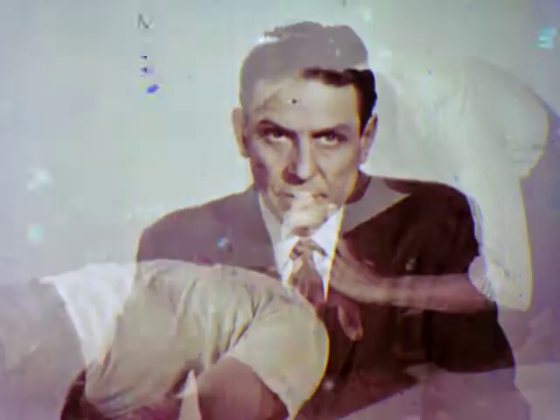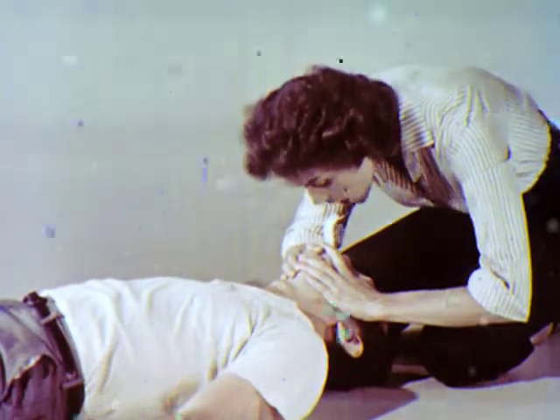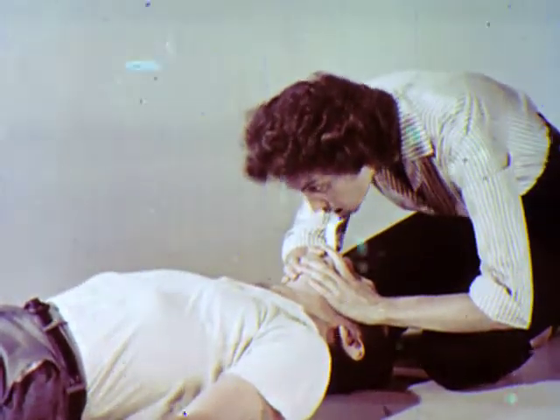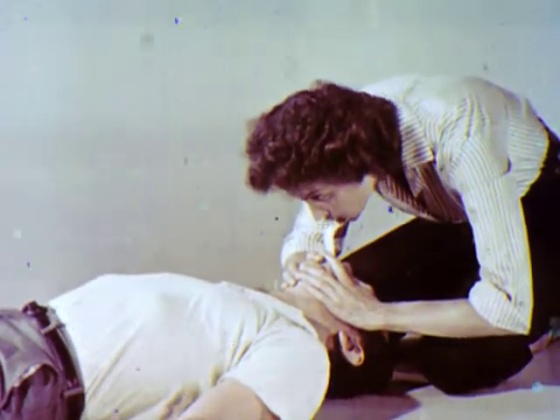Remember, any type of accident causing unconsciousness may result in asphyxia. A non-breathing person will die in a very few minutes if air has not gotten into his lungs quickly. Practice the methods of exhaled air resuscitation you have just seen. In the mouth-to-airway method, insert the short end for practice purposes. In an emergency, if the resuscitation tube airway is not immediately available, do not waste valuable time looking for one. Start direct mouth-to-mouth breathing at once.